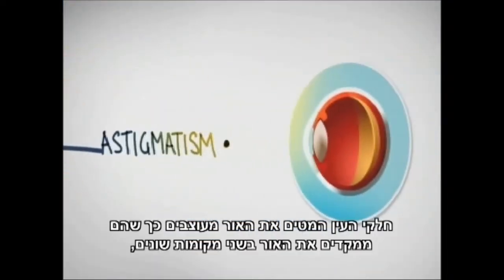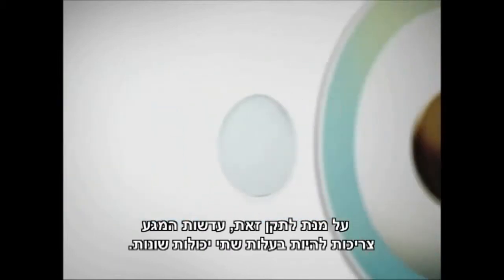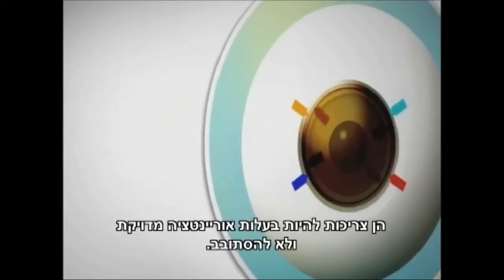In an eye with astigmatism, the parts of the eye that bend light are shaped so that they focus that light in two different places, leading to blurred vision. To correct this, contact lenses need to have two different powers, so they have to be precisely orientated and not rotate.